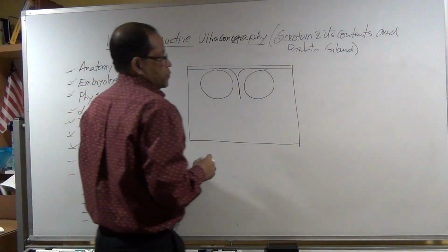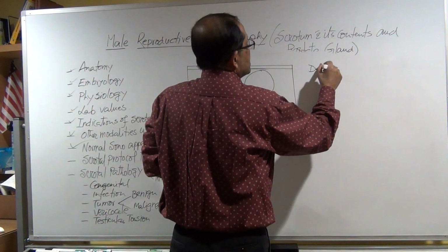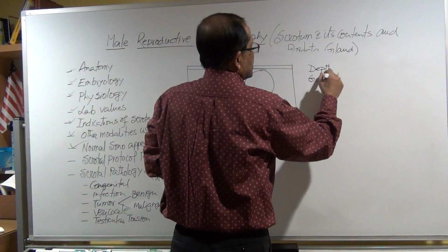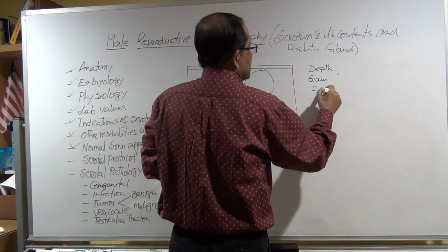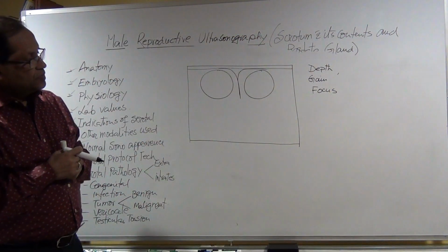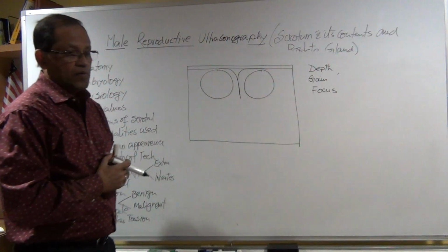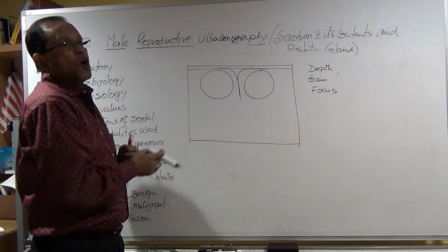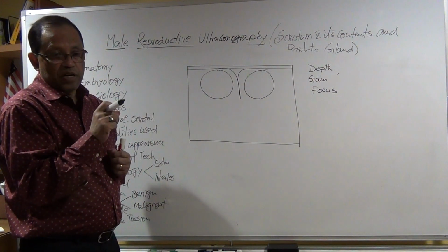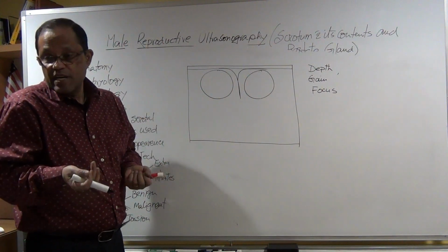At the beginning, make sure you fix the depth, gain, focus. Don't change the gain. Even if you do the Doppler, don't change the color Doppler gain for every image. Otherwise you will manipulate the color.